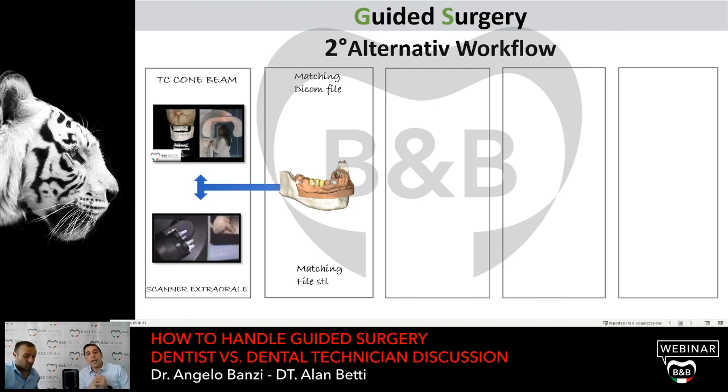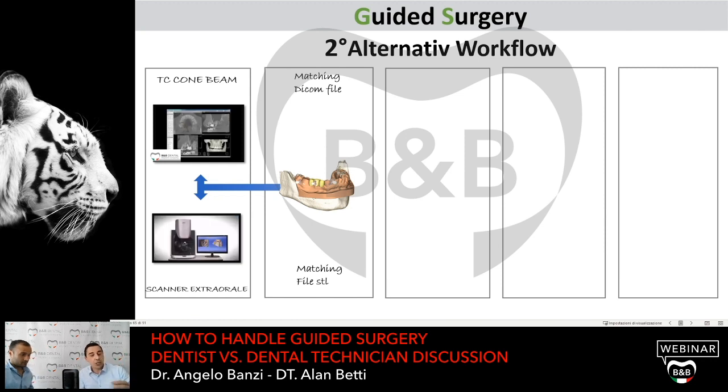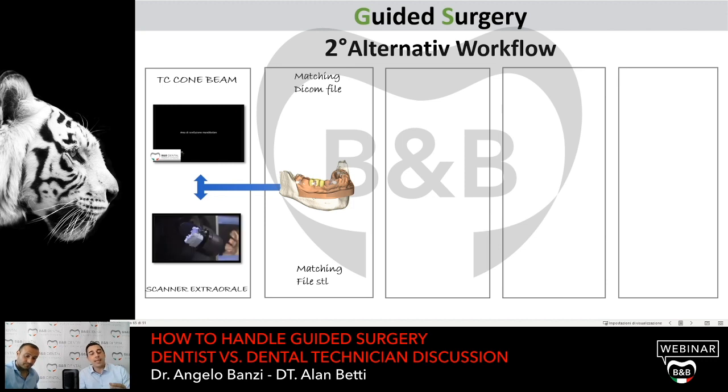The mouth and the teeth have to be absolutely free from metal: crowns, bridges, big reconstructions. If you have just 4 teeth in the patient's mouth and 2 of them have a big reconstruction, you have to use the radiological template.